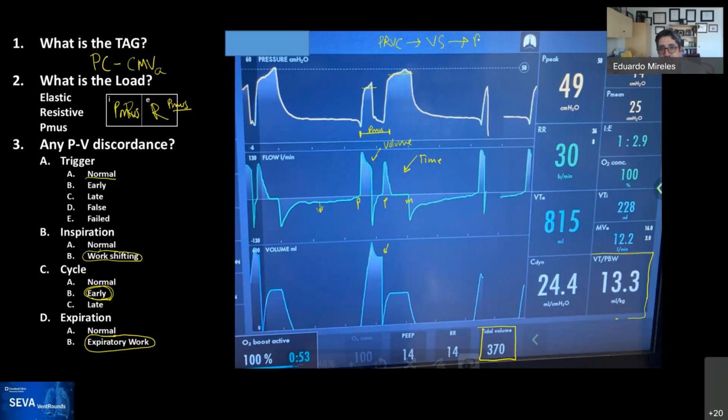Then we tried pressure support, and with pressure support, we were having very large tidal volumes. And so the question then becomes, okay, I can make him synchronous without having this stuff happening, but what is your goal? If your goal is safety, then you may be more inclined to sedation and paralysis if needed. And if your goal is comfort, then your thinking should move towards, well, am I going to extubate this patient? Do I take out the pain or whatnot?